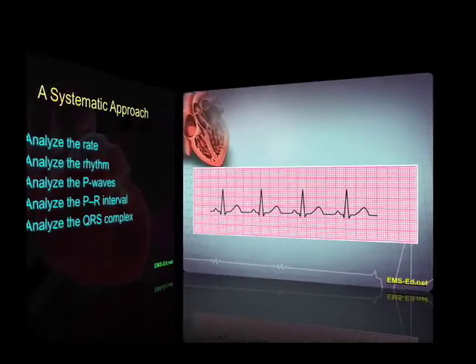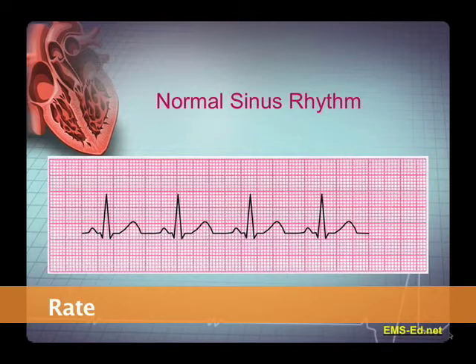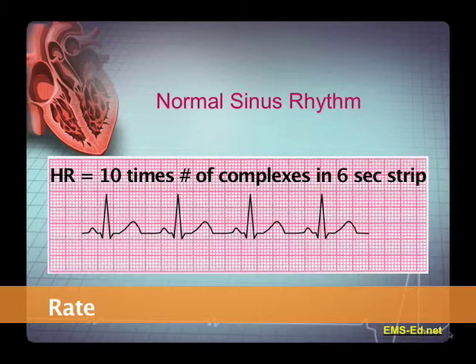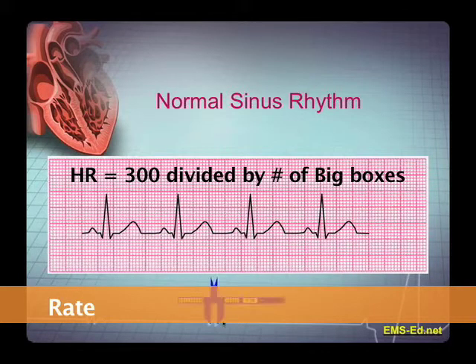So now let's jump in. Before we know what is abnormal, we need to know what is normal. Let's be systematic. First, what is the rate? We could count the number of complexes in a 6-second strip and multiply by 10 to get our heart rate. But this is not a 6-second strip — no problem. Count the number of big boxes between R waves and divide that number into 300, and that is the heart rate.